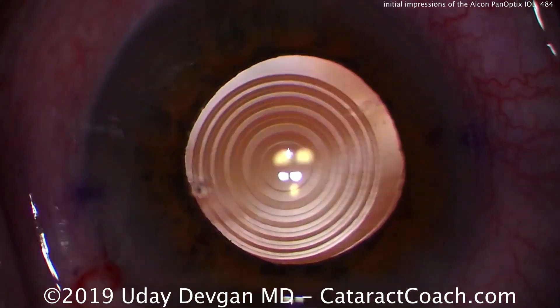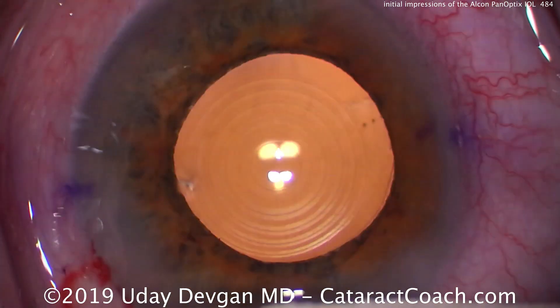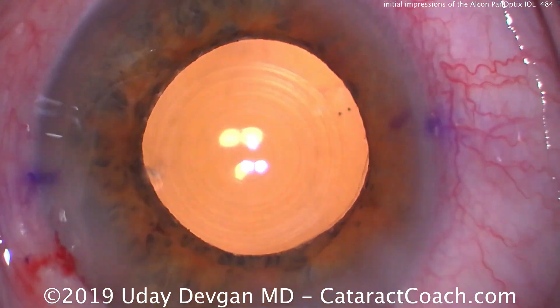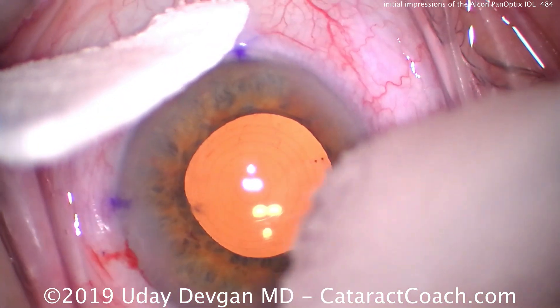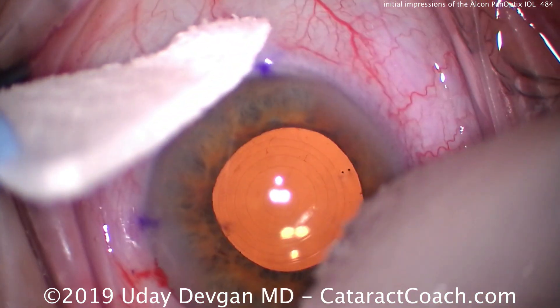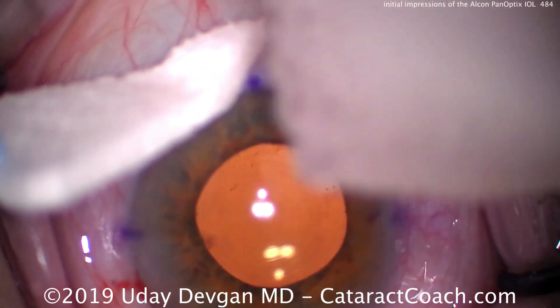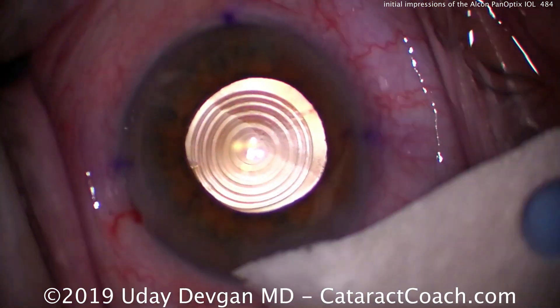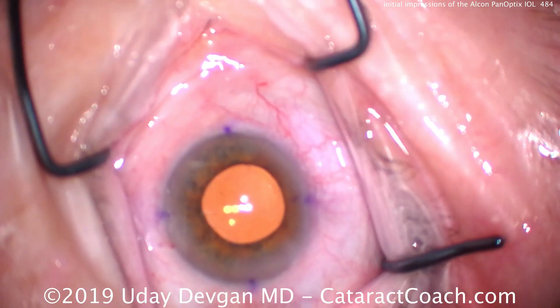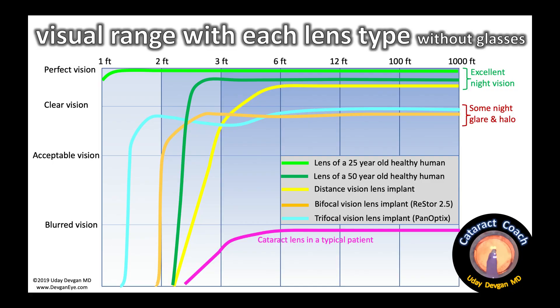At the end of the case we're using those Purkinje images to help line up the central ring right in the middle. We're also lining up our toric marks — there on the lens — with the marks on the cornea. I'm demonstrating to my technician how we line up the toric marks. This patient had a beautiful outcome: 20/20 for near, 20/20 for intermediate, and 20/20 for distance.